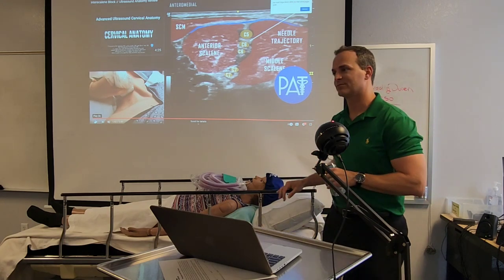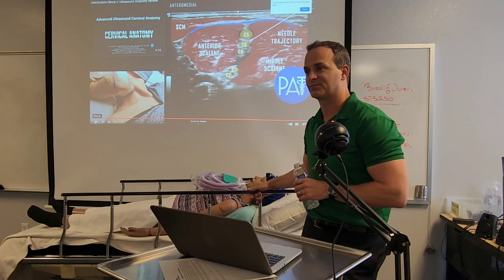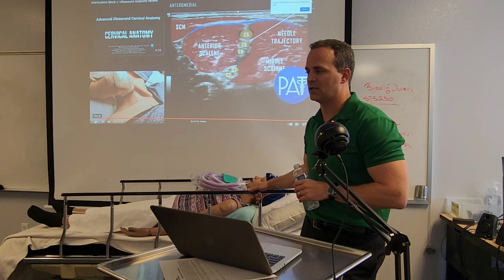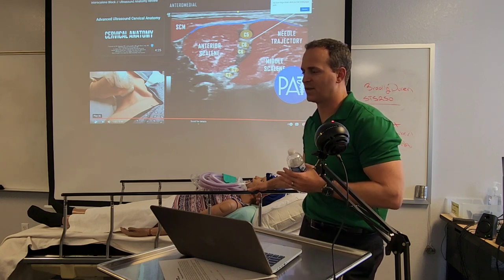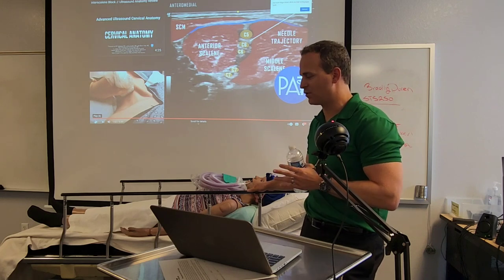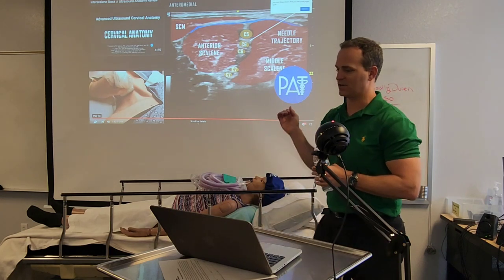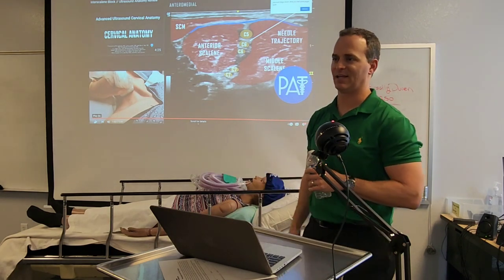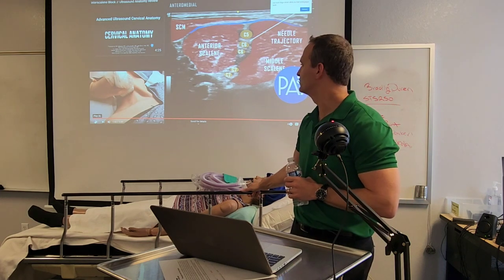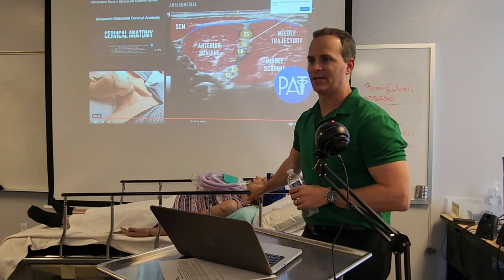Is that just from like pushing on the nerve that it does that? The nerve stimulator like itself? Why it twitches? Because the electric current is operating the same way our nervous system works. And so you have motor nerves, sensory and motor nerves that run through here. So once you apply the electric current to the motor nerve, it instantly initiates a contraction, a muscle contraction. So we place these every day, like for shoulder surgery.